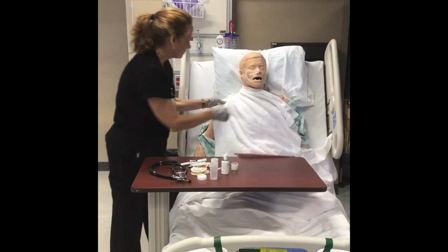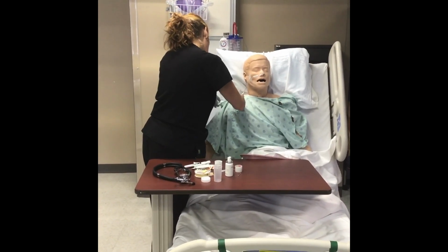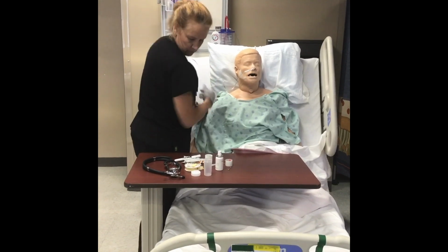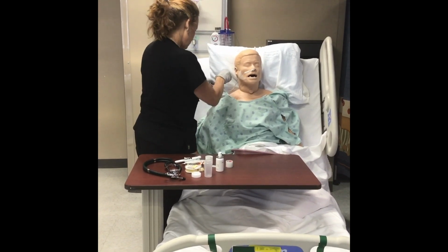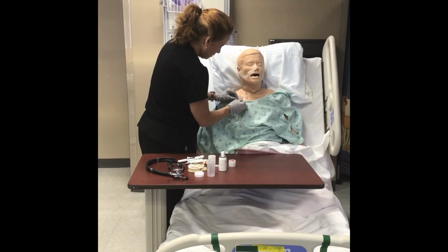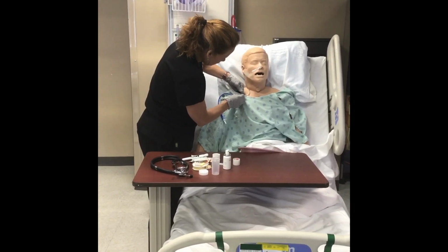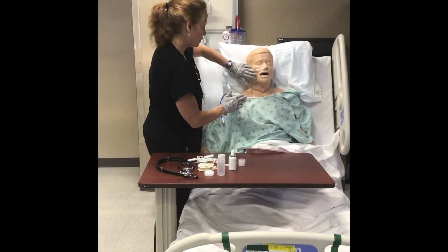Okay, how does that feel? It's okay. Not the most pleasant, I'm sure. I'm just going to tie you back up here. And then my final step is to secure this to the gown for you so that it's out of your vision. Just gonna do what I call a tube taco. Gonna wrap that rubber band around the tube, and then you're gonna stick the safety pin through that. And you wanna give the patient enough room so that they're not pulling that tube out.